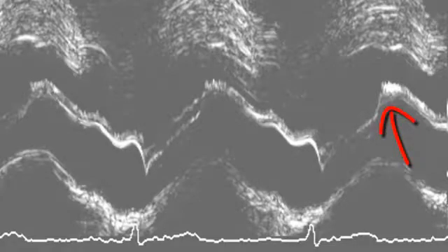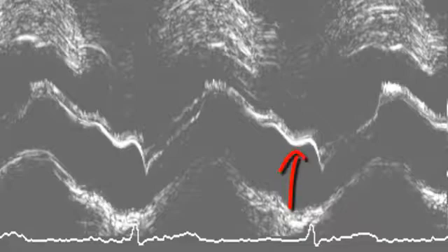This here may look like a smudge, but it's too thin to be sure. Watch the border of the same valve where there is no vegetation, how it is smooth. Completely different from what we see here at the vegetation.